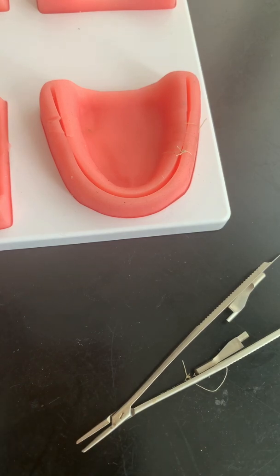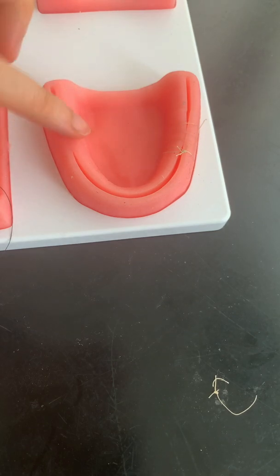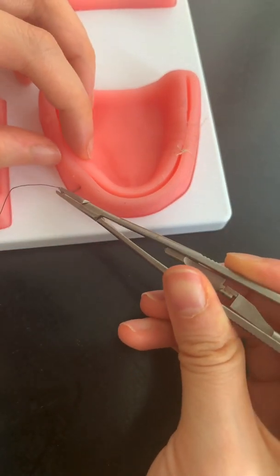Hey everyone! I am in the middle of moving so I haven't been doing suturing videos as much, but I'm going to do one last one before I pack all my suturing away, and that is the continuous interlocking suture. I am going to try to show you on this model that I don't really like because it's already torn just from a few sutures — the quality is not great, but it's the best thing I have, so I'm going to do it in this section.